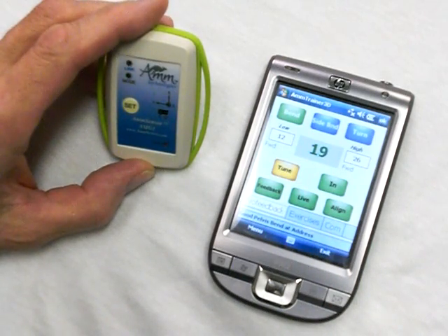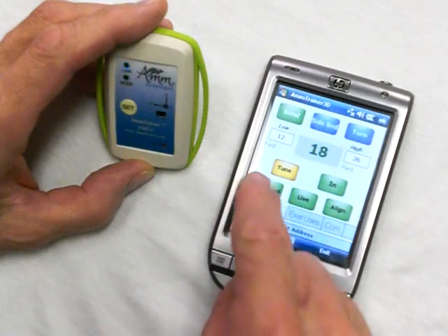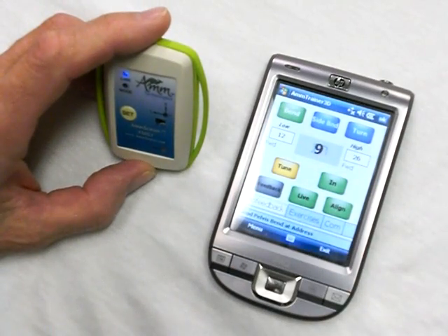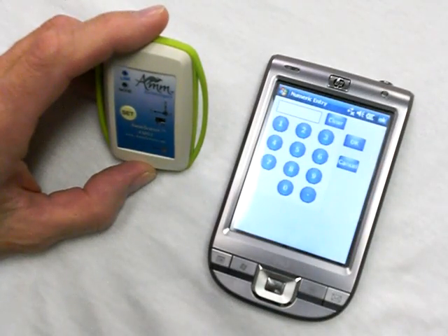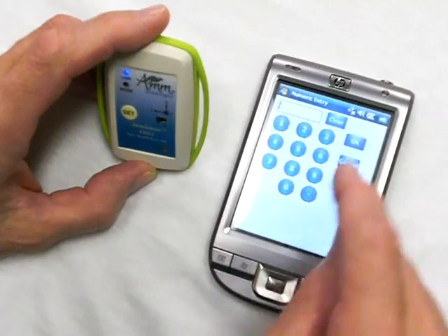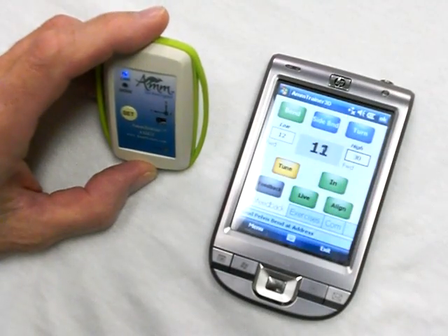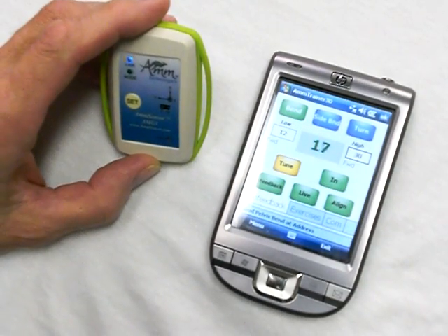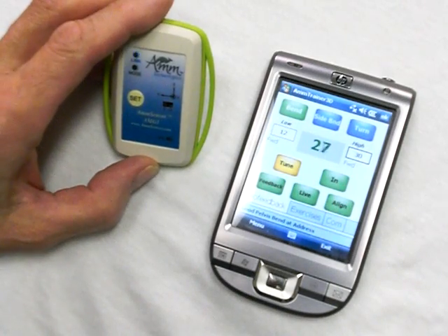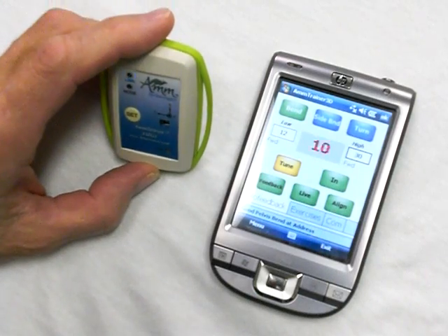So now I've got into the correct bend position, if that was positioned on my pelvis. The other nice thing is I can set my ranges to anything I want. If I click on either one of the two boxes for high or low, I could extend that value — say I wanted 30 instead of 26. Click OK. Now that value is changed to 30. Now it stays in range all the way up to 30 degrees of forward bend.